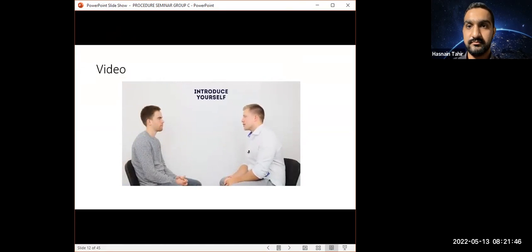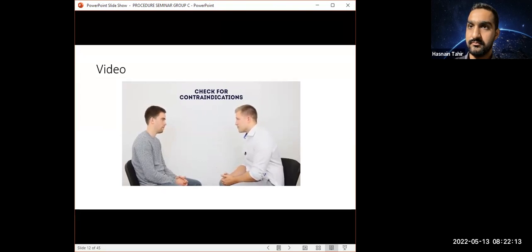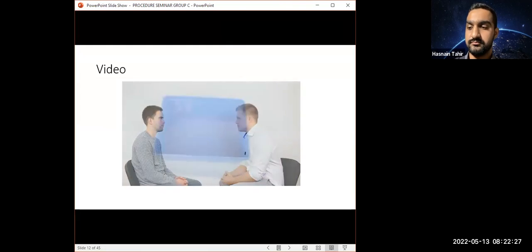Hi there, my name's Andrew. I'm one of the final year medical students. Could I just check your name and date of birth, please? Sure, it's James Alexander, 13th of December 1989. Nice to meet you, James. Today I've been asked to do a procedure called an arterial blood gas. This involves taking some blood from the artery in the wrist. I'm going to use some local anaesthetic, so it shouldn't be painful, but it might be a bit uncomfortable. Is that okay? That sounds fine. Can I just check before we begin? Have you ever been told you have problems with your circulation? No. Okay. Do you take any blood thinners, such as warfarin? No. And have you ever been told that you have problems with clotting? No. Brilliant. Can I also check, James, do you have any allergies at all? No, I don't. Brilliant. I'll just gather my equipment.